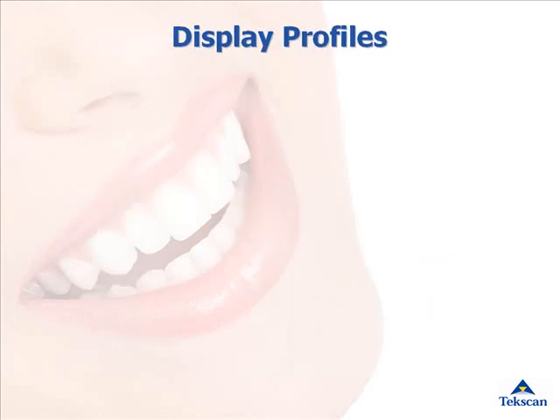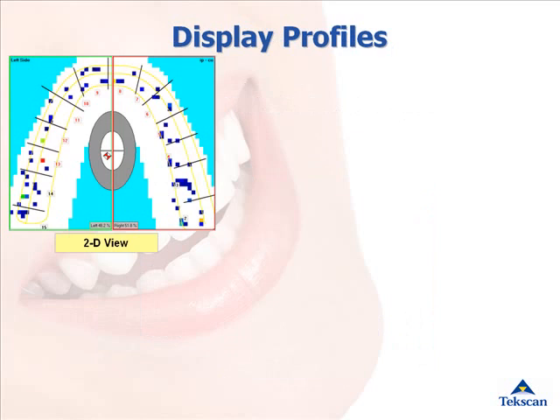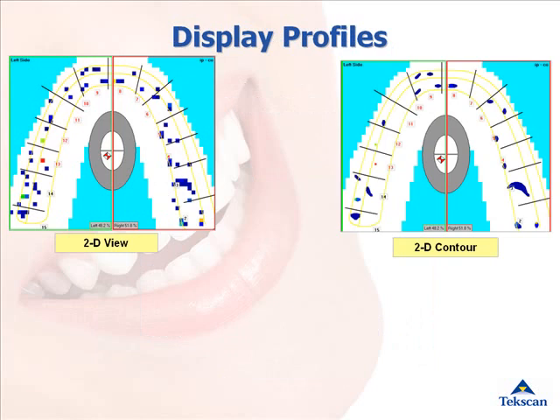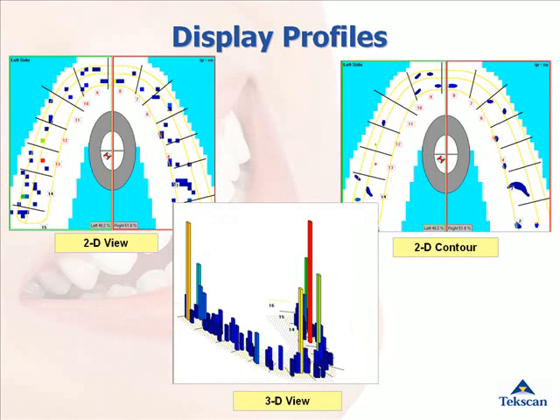T-Scan displays the data in three ways. In the 2D view, which displays raw data, each square represents a contact on the sensor. The 2D contour view averages the connected contacts together, which most closely resembles articulating paper marks. The 3D view is a great tool for patient education because you can see the height of the column correlating with the intensity of the force.